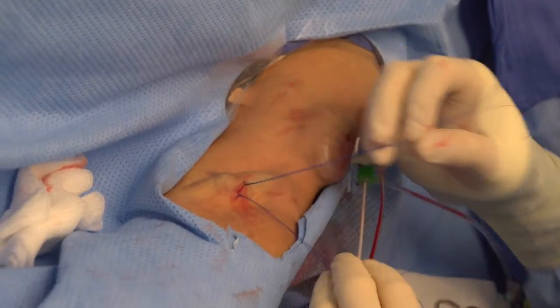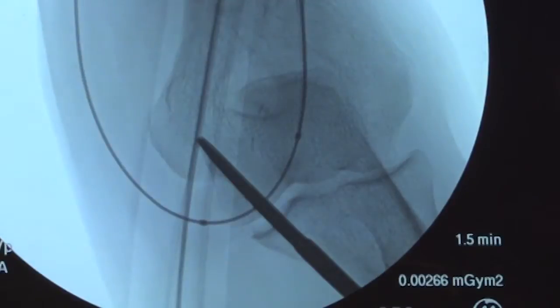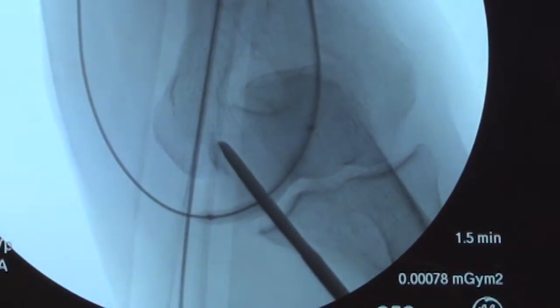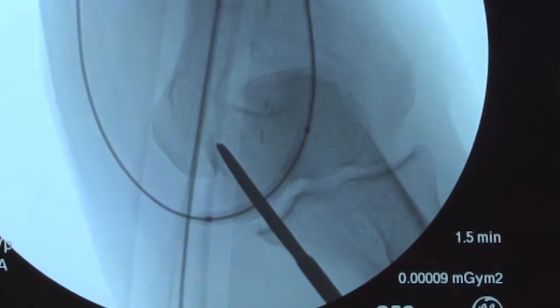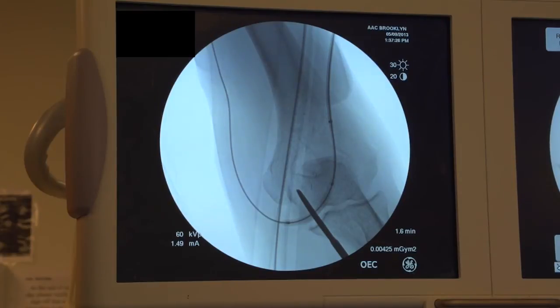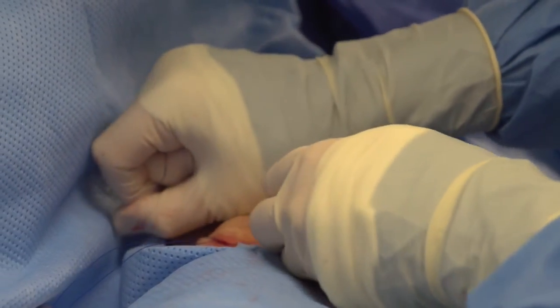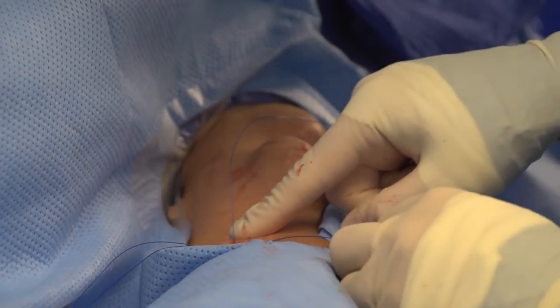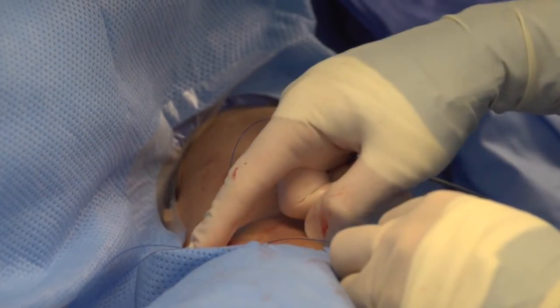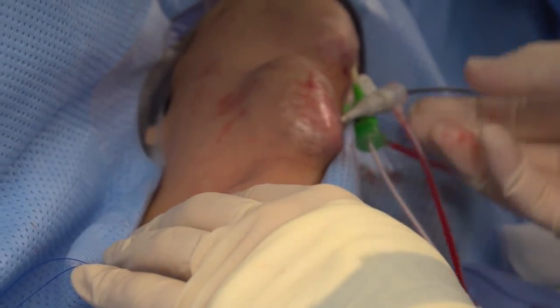This gives us a subcutaneous loop of Prolene suture around the body of the access. We pull through a doubled loop of Prolene so we have two sutures: if the first suture doesn't achieve adequate flow reduction or is too tight, we can remove it and use the second without re-performing the dissection. Fluoroscopy is used to mark exactly where the balloon needs to be positioned. The balloon is inflated as a sizing dowel and we tie the sutures down around it, tying a total of six knots around the balloon until it is completely occlusive.